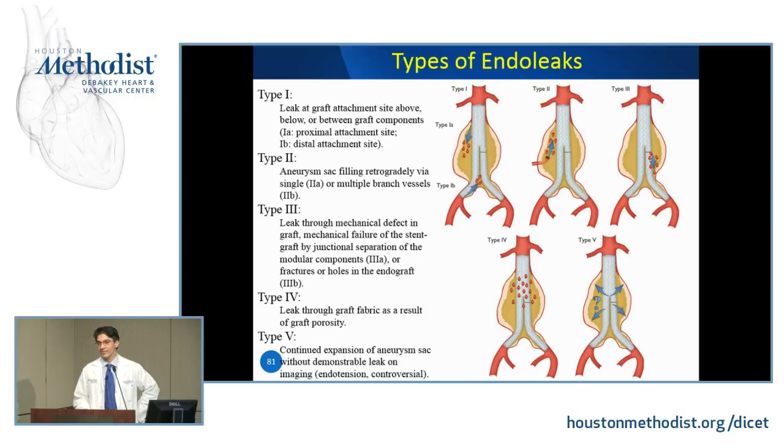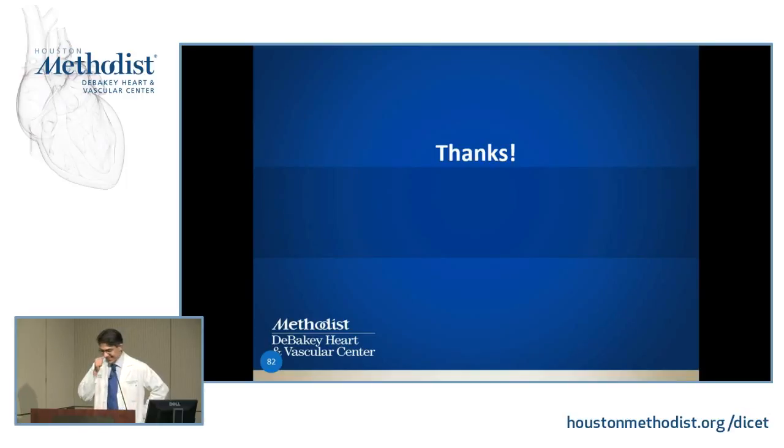And for us, both in CT and CMR, this is now becoming a big part of our business: knowing about endoleaks and making the diagnosis. And these are talks for another day. Okay, thank you.